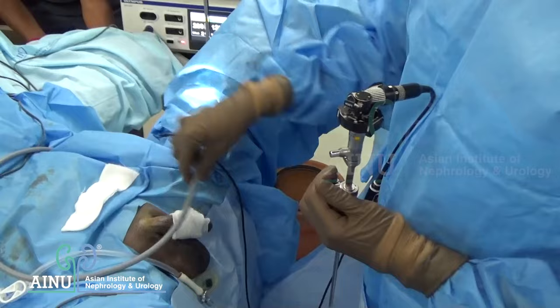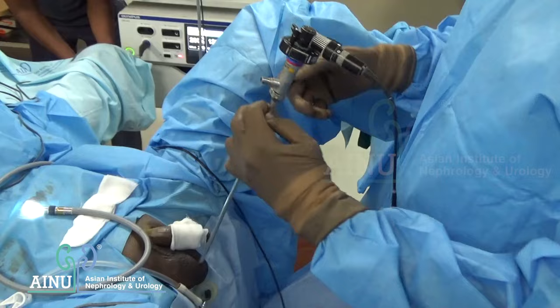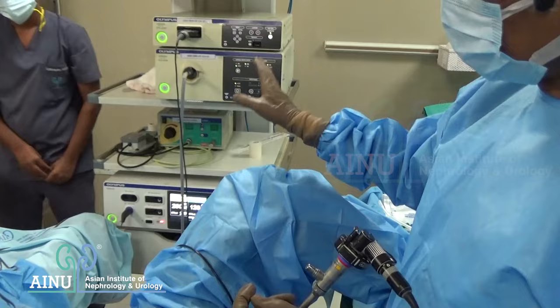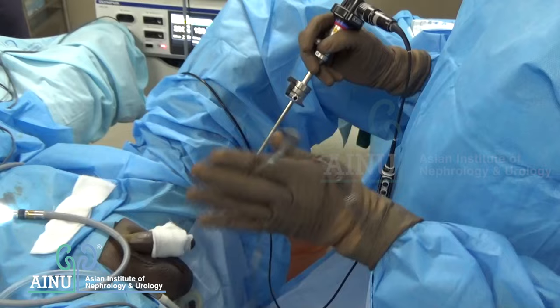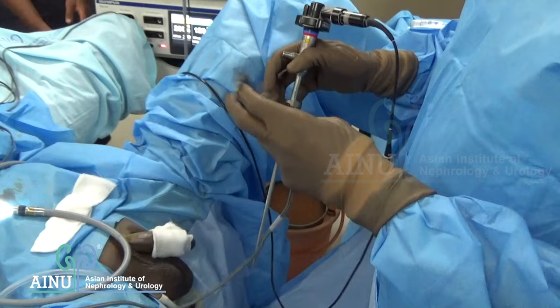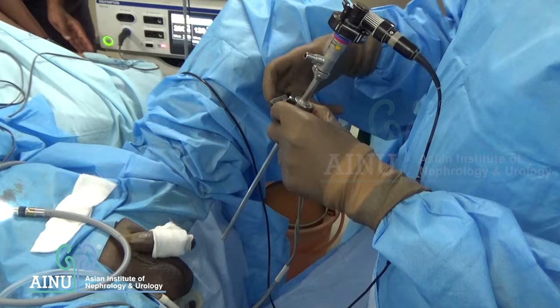The third item is the lightweight pendulous camera cord attached to the cystoscope, which should go to the side where the camera processor is and not cross over. The last one is the diathermic cable. As a right-hander, I keep the diathermic cable on the other side so it doesn't come in the way of my handle. This is a bipolar cable.